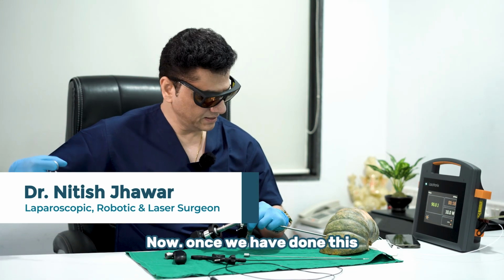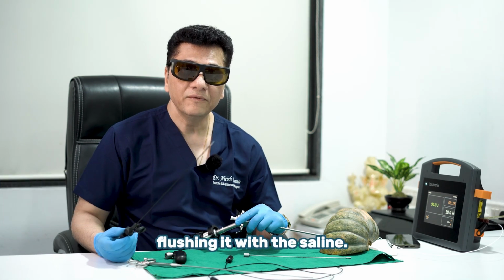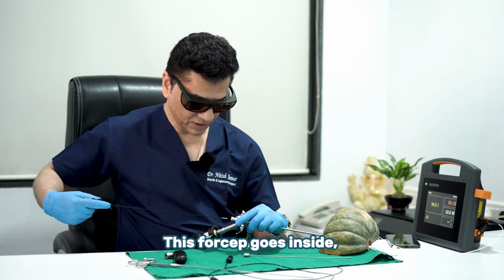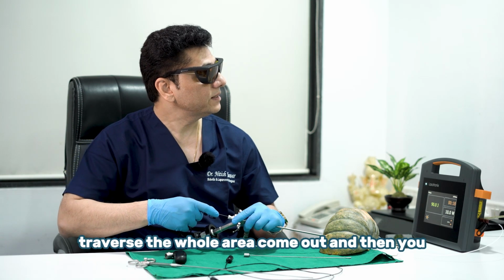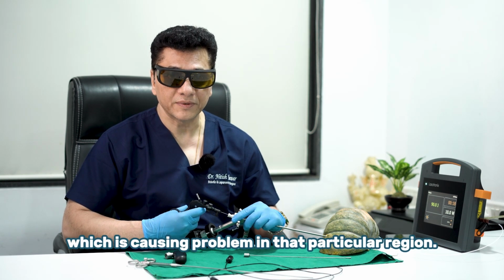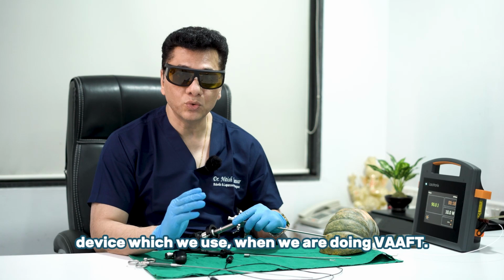Now, once we have done this, and there is a possibility that a part of it is not coming out just by using the brush or by flushing it with the saline, when you try to push the whole muck inside the anal canal, then we can use this kind of a pickup forceps. This forceps goes inside, again through the same channel. You traverse the whole area, come out, and then you can open the jaws and take out the debris which is causing problem in that particular region. So these are the various energy sources and the devices which we use when we are doing VAAFT.